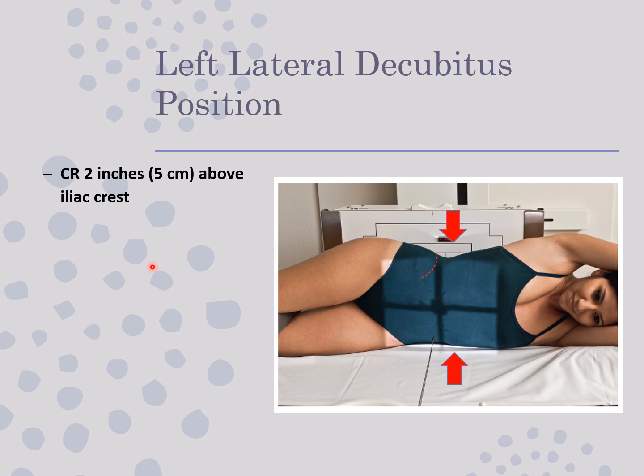On this particular image, the patient you can see is on their side. So when we talked about decubitus chest, we said they had to be on their side a minimum of 5 minutes. That's the same for this. I will tell you that 10 to 20 is actually preferred because that will best visualize any small amounts of intraperitoneal air. There's more to layer out in the abdomen than there is in the thorax.